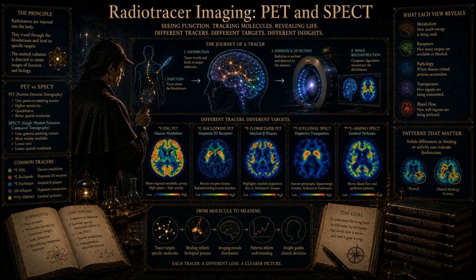Precisely. It looks at the mathematical difference between the guess and reality, updates its initial image to be a little bit closer to reality, and then runs the entire massive calculation again. That is one iteration. Right. It repeats this iterative loop over and over, constantly refining the image until the mathematical model optimally matches the observed data. And the resulting images from OSEM are visually stunning compared to the old method. They're smooth, the streak artifacts are completely gone, it looks much more like a real anatomical brain.